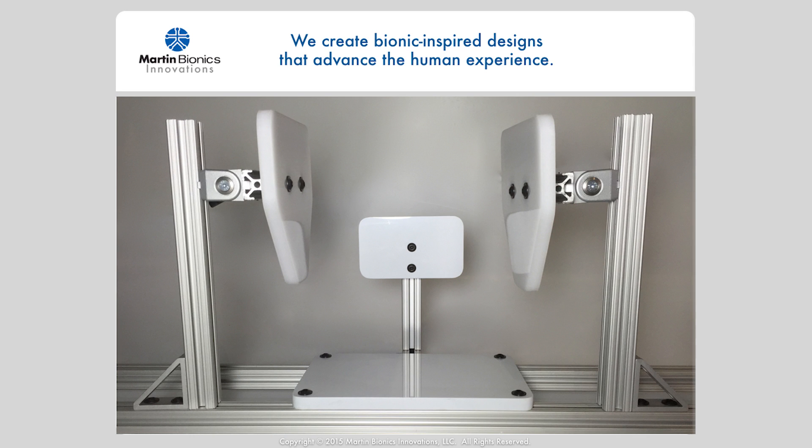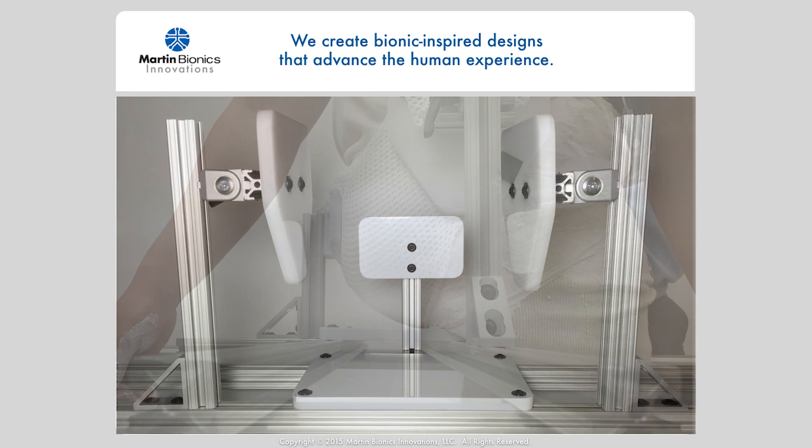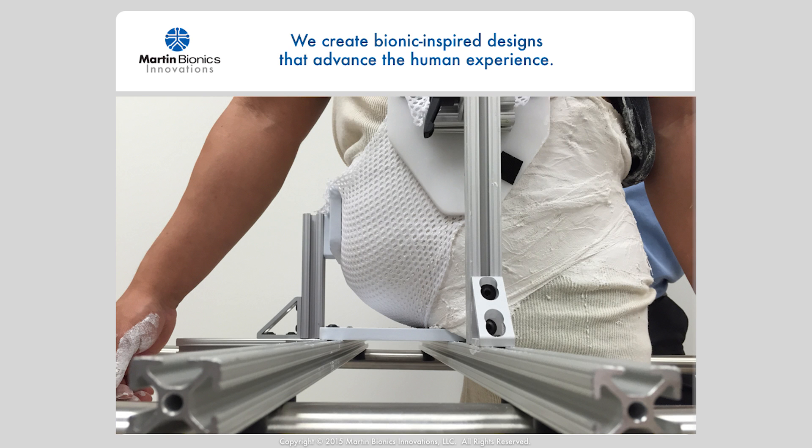Our new patent-protected hammock casting stand provides an even better capture of the underlying anatomy in the casting process. Using our unique force distribution techniques, we now cast the user while suspending them in a fabric hammock, which provides a socket that is perfectly contoured to the underlying anatomy.